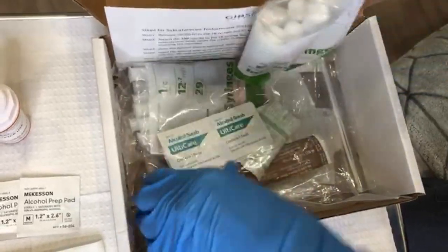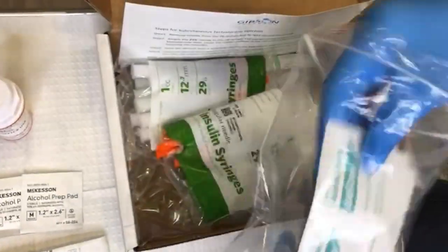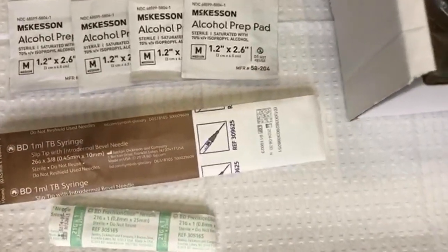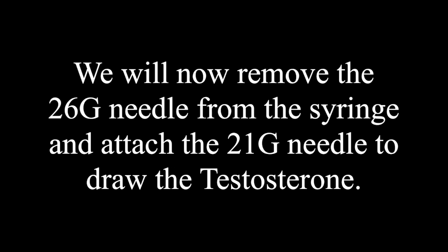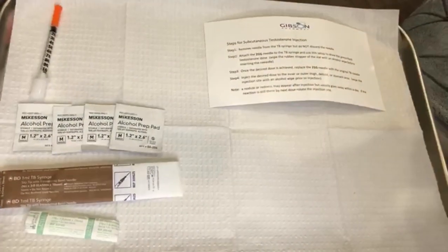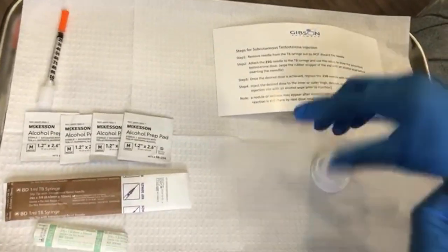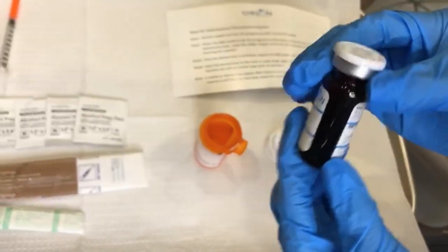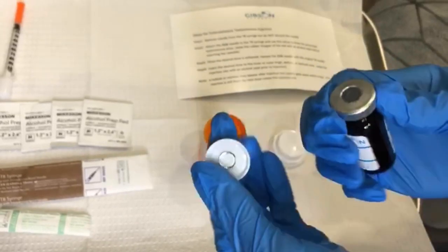You'll be receiving a kit from the pharmacy which should include all the supplies needed to administer your injections. So at this point we're ready to go ahead and draw the medication from the vial. Pop the cap off of the vial and clean the top of the vial thoroughly with an alcohol pad.